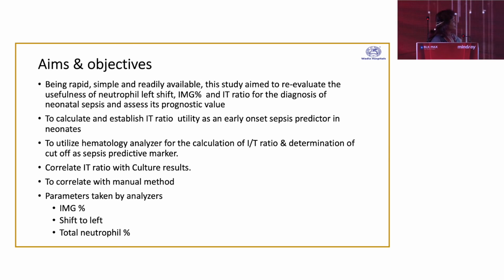To utilize the hematology analyzer for the calculation of the IT ratio and determination of a cutoff as a sepsis predictive marker, and to correlate the IT ratio with culture study results, and with the manual method, IT ratio calculation by machine versus manual. The parameters we took were IMG percent, shift to left and total neutrophil percent.